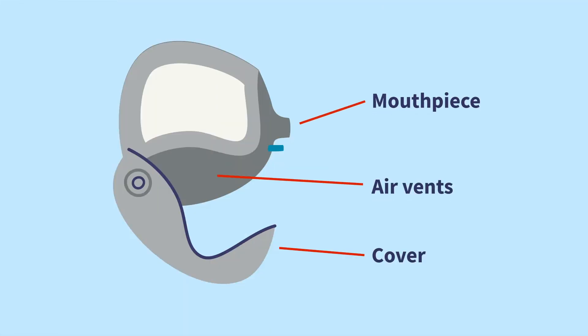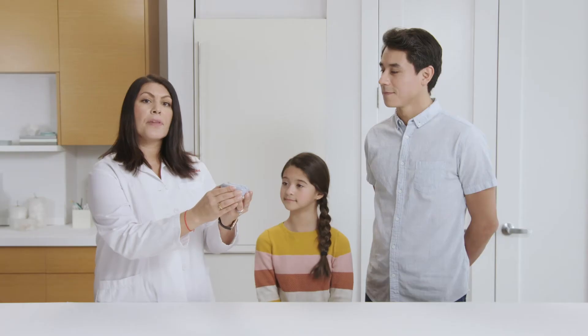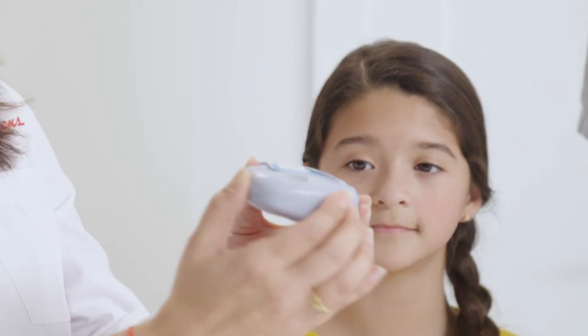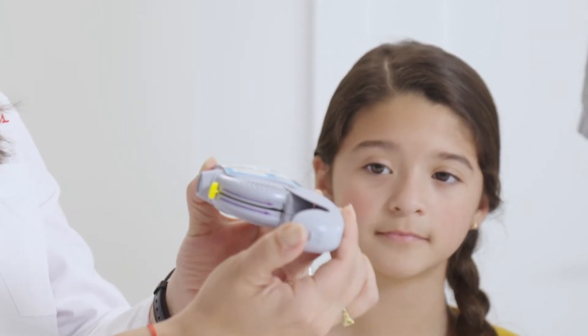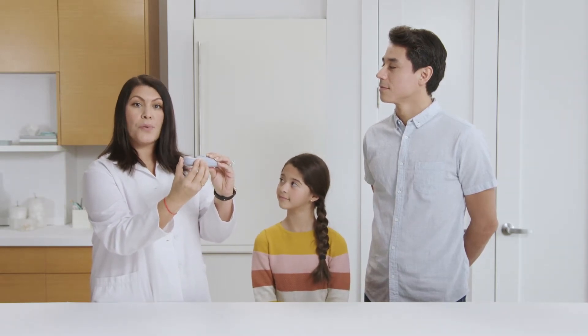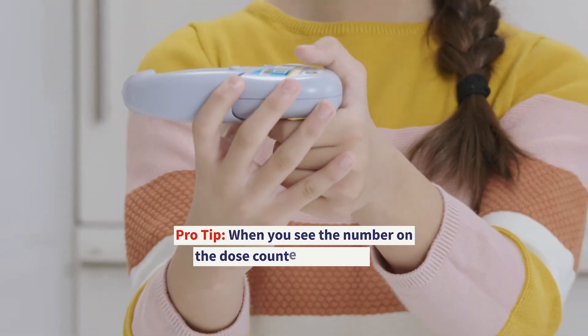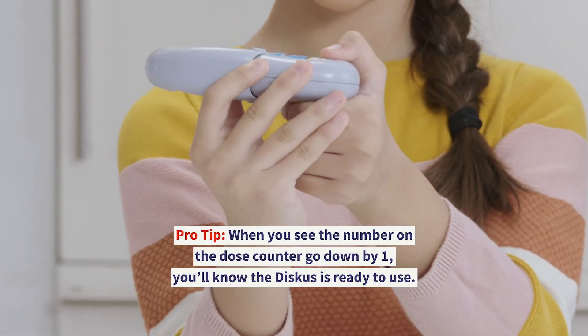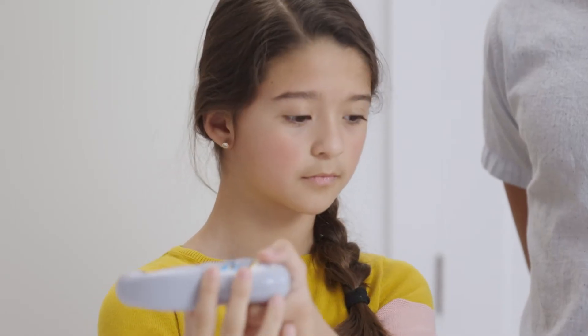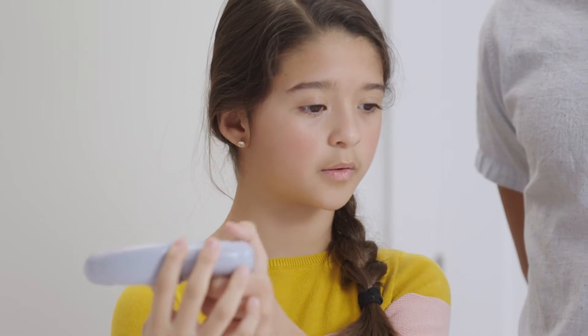Let's start by holding the Discus with the left hand and placing the thumb of the right hand on the thumb grip. Push the thumb grip away from you as far as it'll go until the mouthpiece shows and snaps into place. Hold the Discus in a level, flat position with the mouthpiece towards you. Then slide the lever as far as it'll go away from the mouthpiece until you hear a click. Next, exhale completely through your mouth with your head pointing away from the Discus, and make sure not to tilt or shake the device.